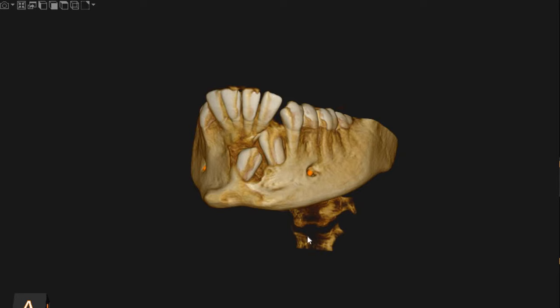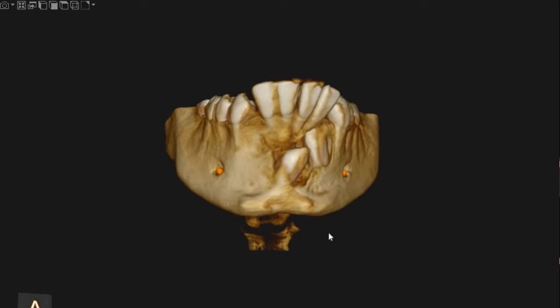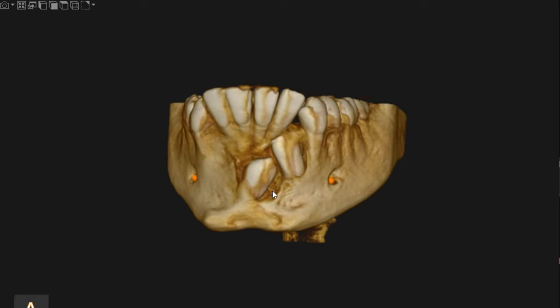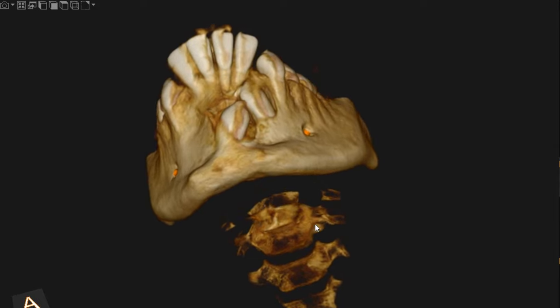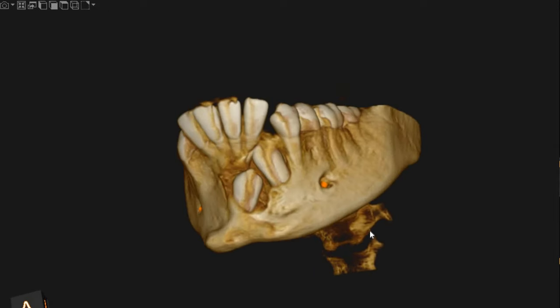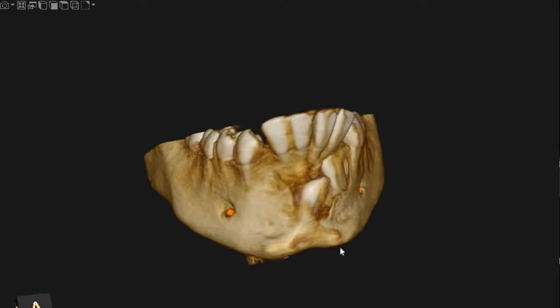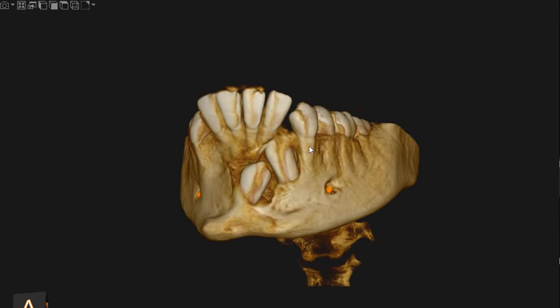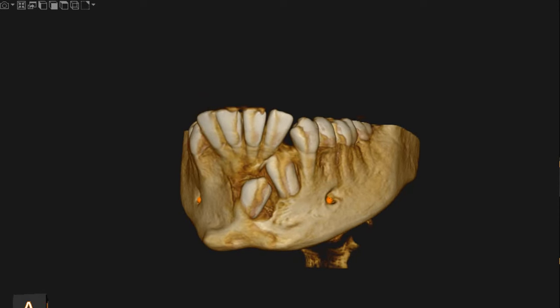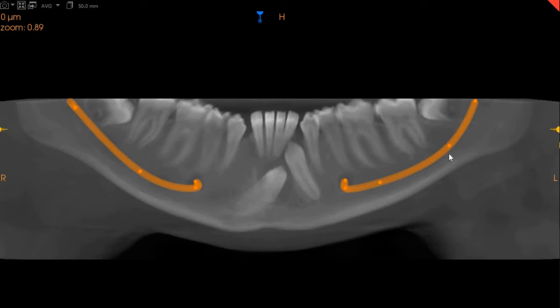Hello and Assalamu alaikum, Ultra Scan Diagnostics here. This is the CBCT of the patient that you had requested. The area of interest is the lower jaw and the lower canines, right and left, which are impacted, as you can very clearly see. This is the panoramic view for better understanding.